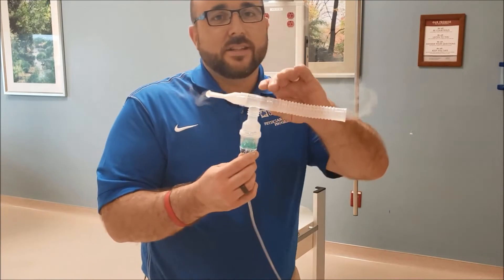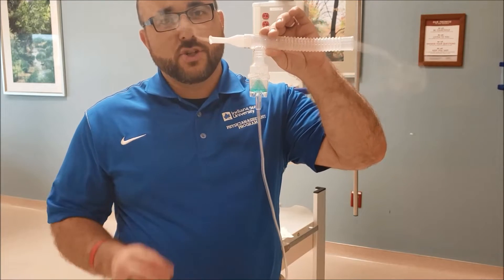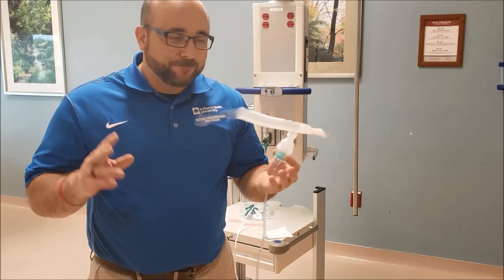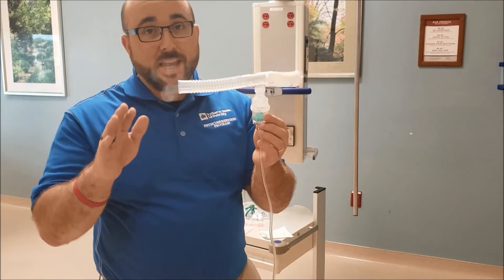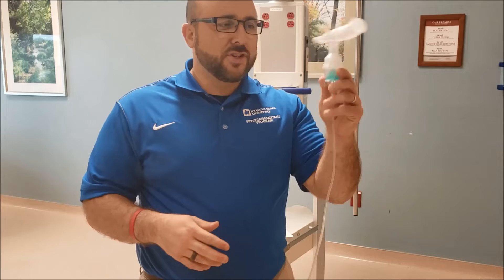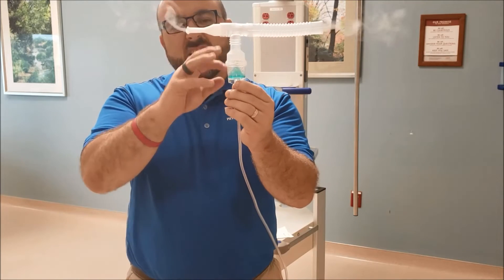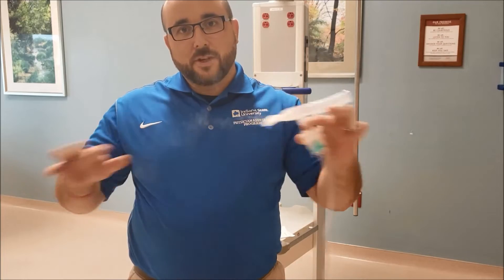As this thing is running, you're going to hear a change in the sound — it's called sputtering. It's really just running out of medication. Once you start to hear a sputter, the particle sizes are no longer three to five microns and you should stop the nebulizer. Technically, that's exactly what you should do. Now, there are a lot of patients — and we're in customer service — so a lot of patients will say there's still some medication in there and they'll want you to tap it. You tap it, knock some medication off the sides, and maybe they get one or two extra breaths before it starts sputtering again. It makes the patient happy, so I go with it. But technically, when it starts to sputter, the treatment is finished.